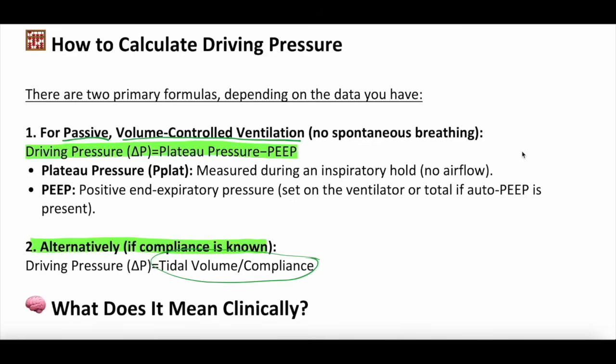If you do not know what a plateau pressure is, this video is probably a little beyond where you're at. We have a whole playlist on all things mechanical ventilation where we dive into plateau pressure. It's linked in this episode's description, so definitely check that out and then return to this. For those of you who do know what a plateau pressure is, friendly little reminder, you have to get a plateau pressure with an inspiratory hold.